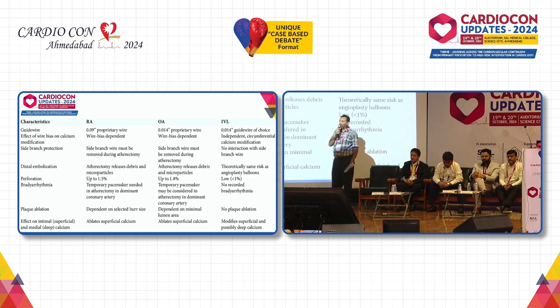The third thing is whether to use orbital, IVL, or rotational atherectomy. Of course, rotational atherectomy is proven for the long term. However, it requires expertise to use it. While IVL is more user-friendly, the long-term data are the same. With IVL, the only thing is we have to negotiate the lesion. If the lesion is calcified, IVL is difficult to negotiate. Tortuosity of the lesion or artery, IVL is difficult to negotiate. Otherwise, IVL is a safer tool than the orbital or rotational atherectomy.